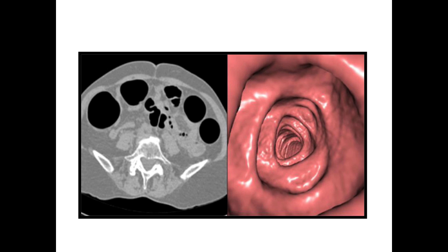Here is an example of a fly-through view of the colon created by the computer — this is a 3D reconstruction. On the computer you can start at the anus and fly up the colon virtually. And this is the conventional 2D view, which radiologists are trained to look at, plus you can have coronal and sagittal views.